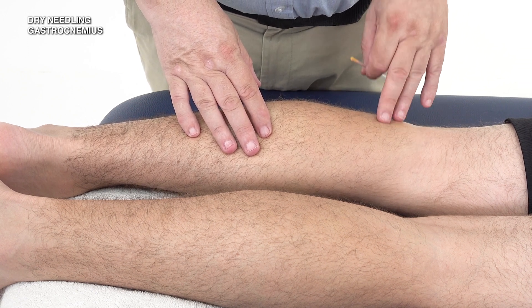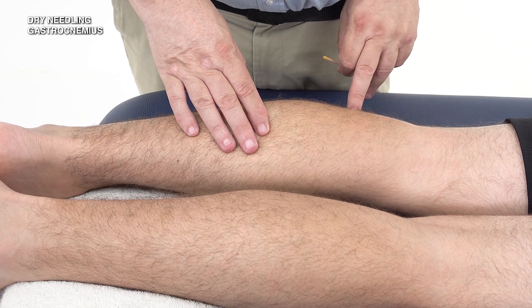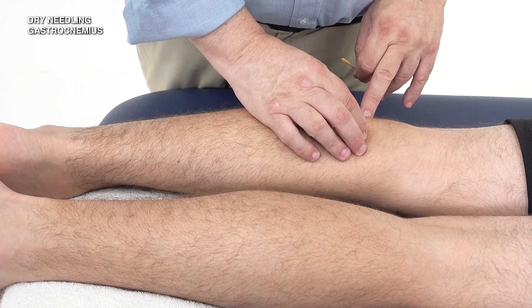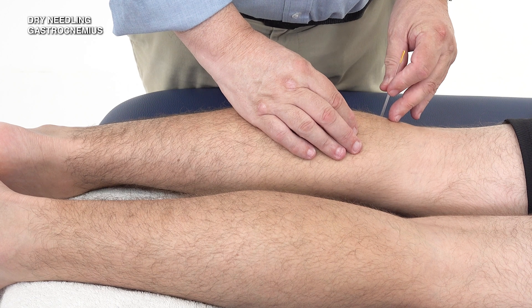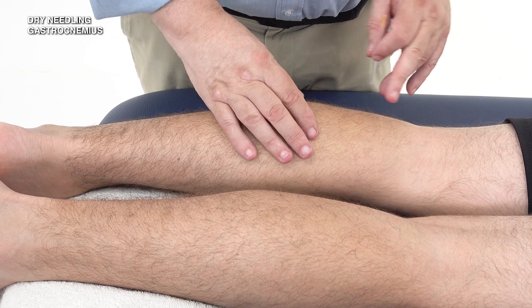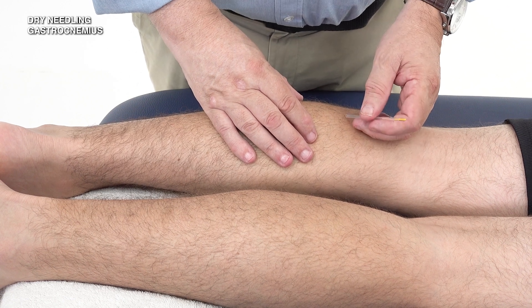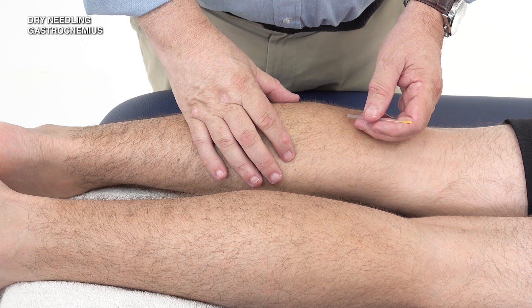Be aware of the location of the peroneal, tibial, and sural nerves — the superficial peroneal nerve in particular is very close to the lateral head of the gastrocnemius. So you don't want to be fishing around with the needle near the head of the fibula. Be careful of the various neurovascular structures in the area and work with the patient to get feedback.